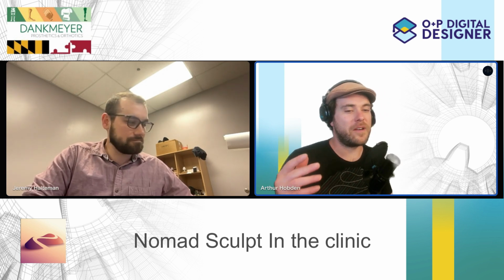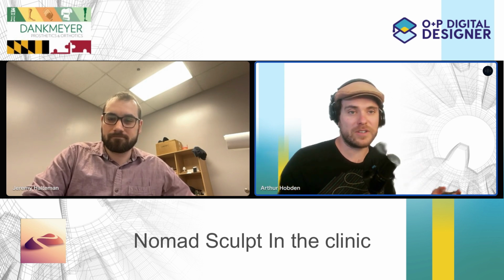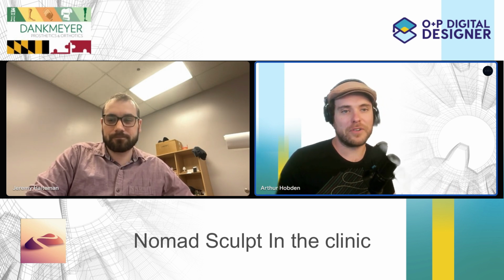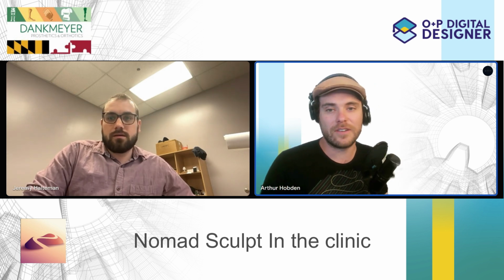So with the stylus, I was trying to push that and always got pushback, trying to get people to adopt a stylus workflow, because it potentially gives you a one-for-one transfer of plaster skills into digital spaces, in my eyes anyway. I never really got that off the ground, but would you now say this is a next level above that? Yeah, it's a lot more similar to that. I still do a lot of my modifications with the gizmo tool, so I can be very precise on how far I'm moving or carving something. But I take advantage of the Apple Pencil's pressure sensitivity, especially for the smoothing operations, so you can really control what you're doing.